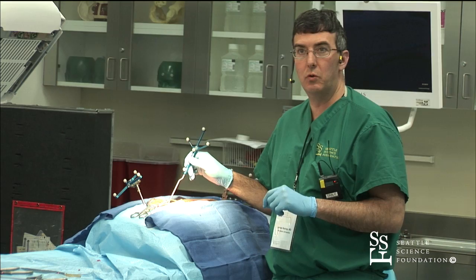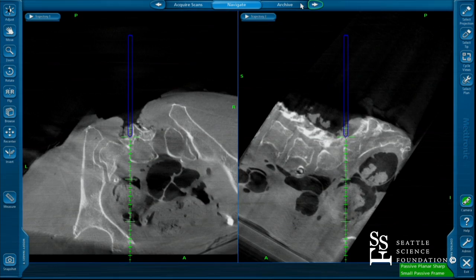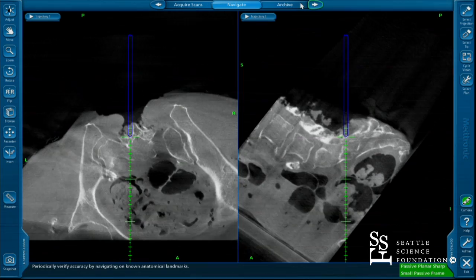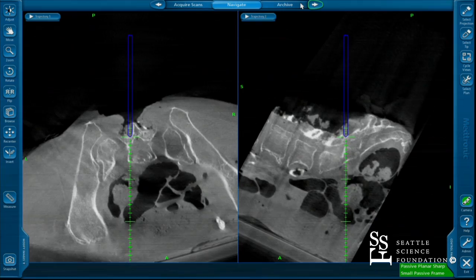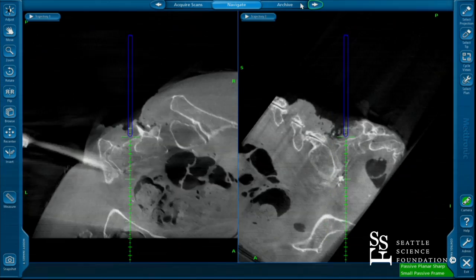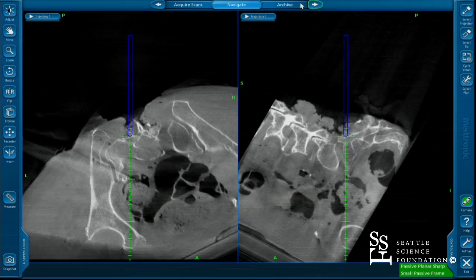So what you have to be is very careful and lay the instrumentation exactly where you want it. And you can see — I think you guys see the image right now — we have a beautiful picture of the pelvis, very nicely done. So with an S2 screw, the way I do my S2 screws is we dissect everything out and you find the S1 and the S2 foramen. Once you find your S1 and S2 foramen — and you can see right here, I am now in the S1 foramen and down here is the S2 foramen. Do you normally — so just backtrack for a second: before you place any instrumentation, you double-check where you're at? Correct.